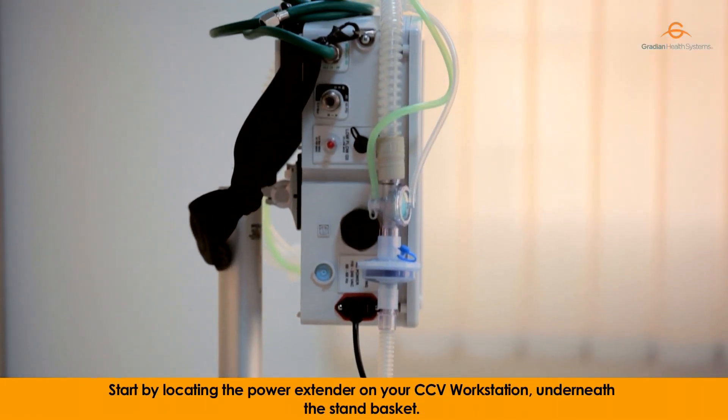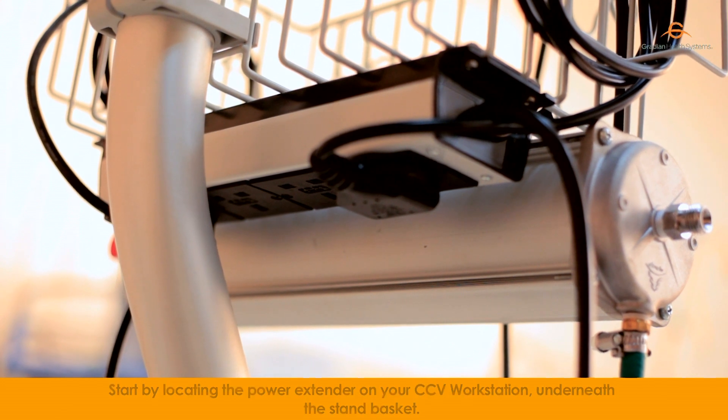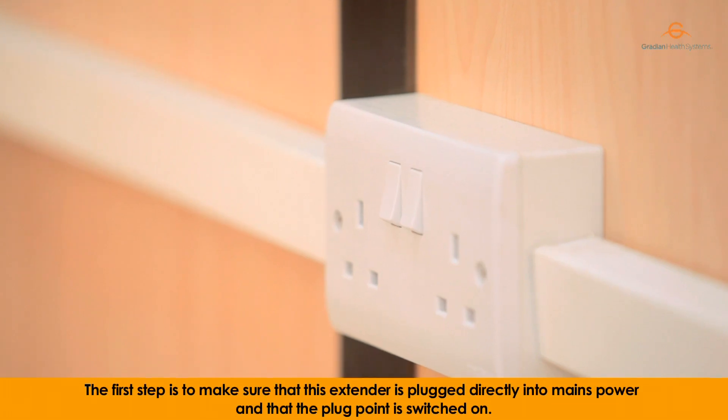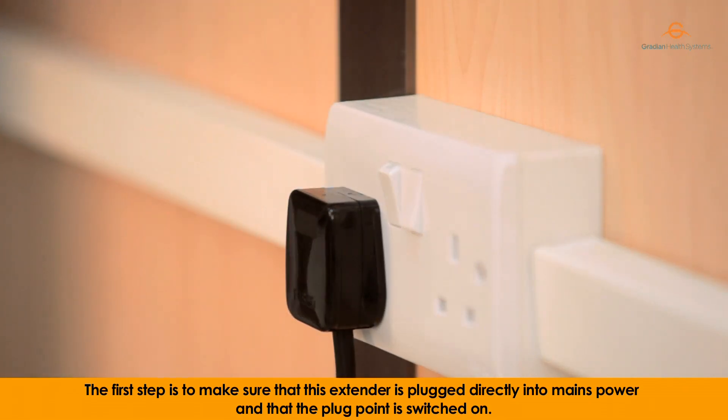Start by locating the power extender on your CCV workstation underneath the stand basket. The first step is to make sure that this extender is plugged directly into the mains power and that the plug point is switched on.